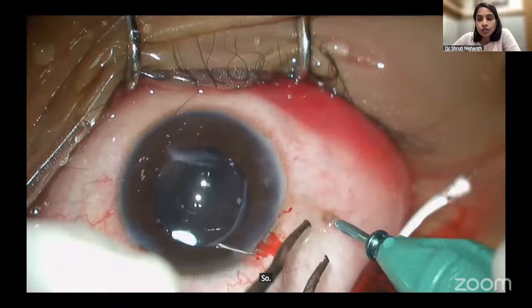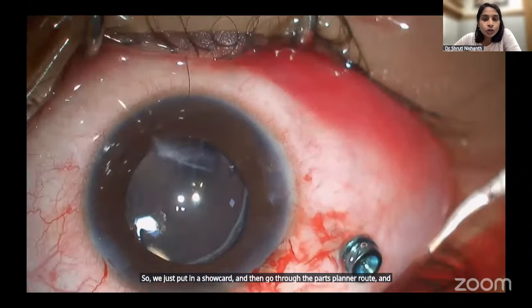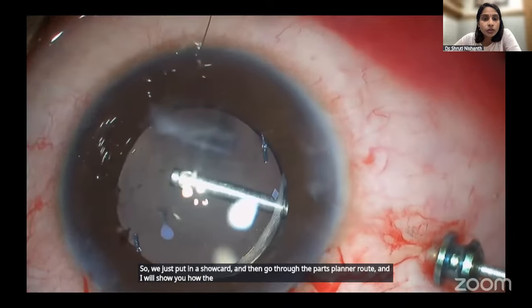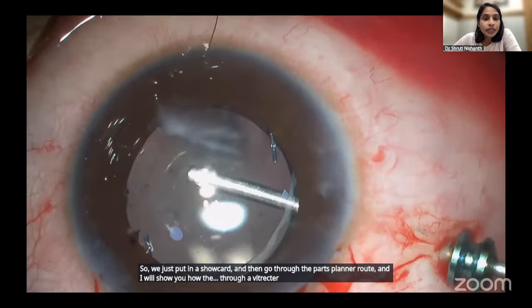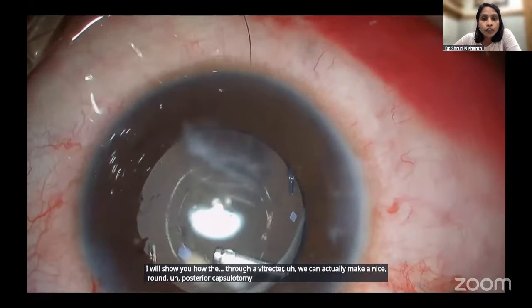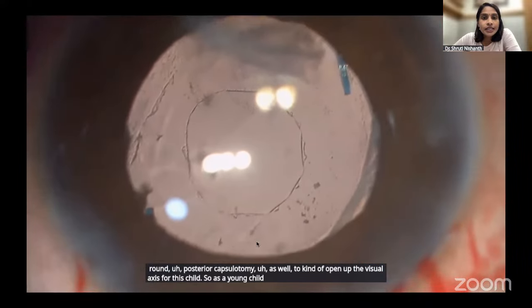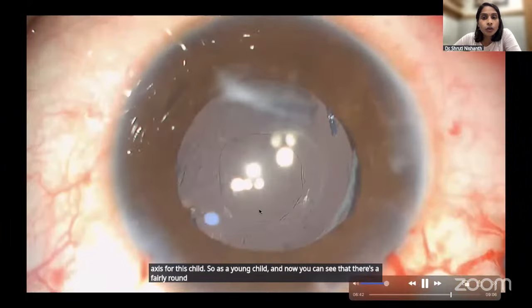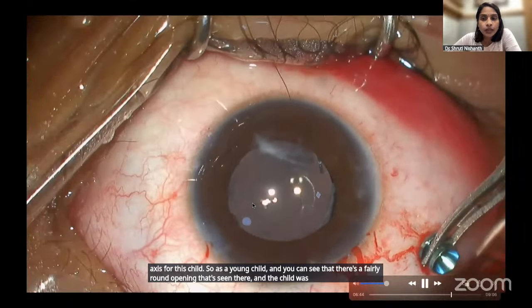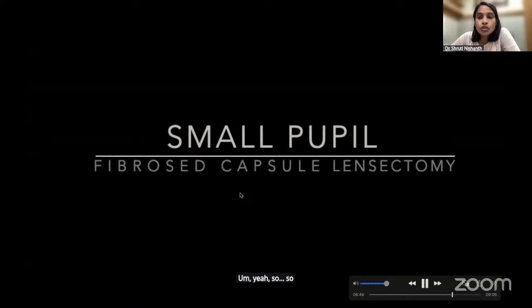So we just put in a trocar and then go through the pars plana route, and I will show you how, through a vitrector, we can make a nice round posterior capsulotomy as well to open up the visual axis for this child. This was a young child, and you can see that there was a fairly round opening seen there, and the child was doing well. So, different approaches to the same cases.